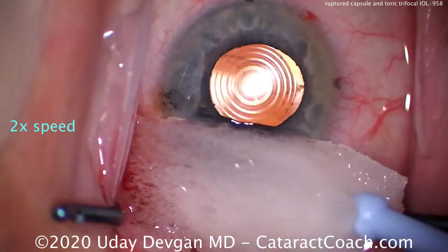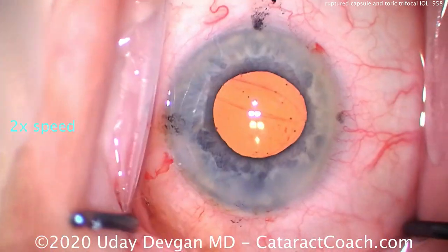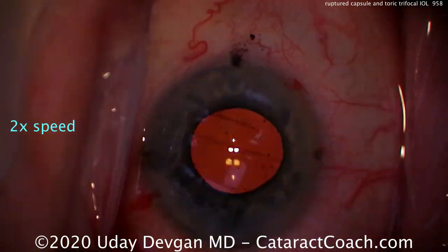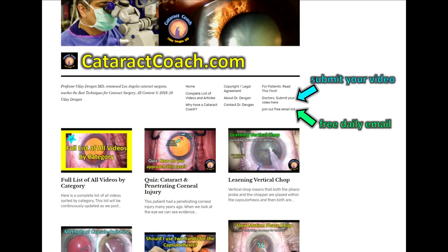The lens is in good position. I'm happy to tell you that the patient did beautifully and had no issues at all — achieved excellent visual outcome and a plano refractive result as well.